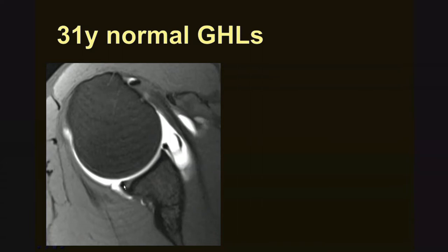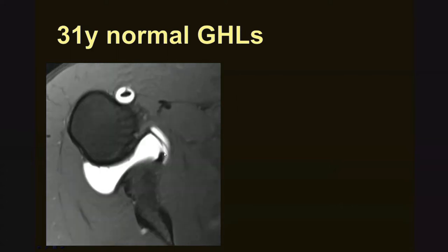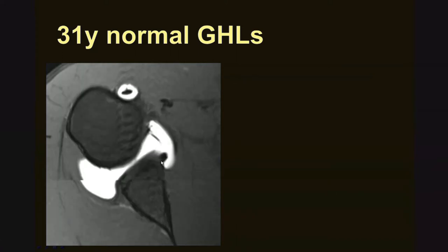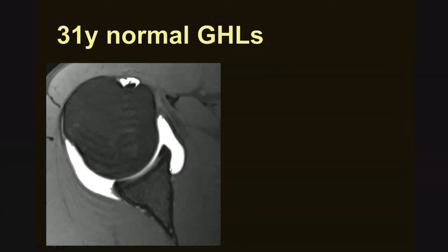Notice here posteriorly, the labrum is normally situated over the glenoid rim and is partially undercut by articular cartilage — that is also normal. As we follow the labrum more inferiorly, here is some cartilage, here is the normal labral contour, and then here is the IGL, the inferior glenohumeral ligament. We follow it back up to its attachment site at the base of the labrum, and you can see how it also partially attaches to the adjacent bone. The labrum can tear here, and the whole labral ligamentous complex can strip medially along the glenoid neck.